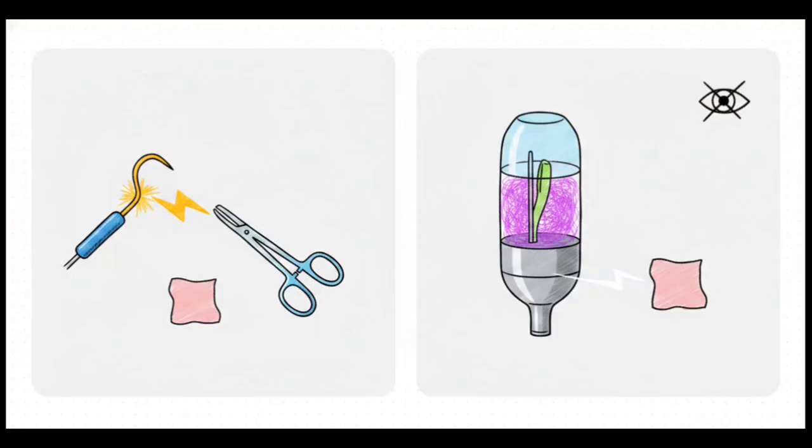Okay, you absolutely must understand the physics of electrosurgical complications for the exam, specifically the concept of coupling. Direct coupling happens when current purposefully or even inadvertently passes from a monopolar instrument straight through another conductive instrument. Capacitive coupling, on the other hand, is a bit trickier. This is where current actually stores up in an active electrode and then discharges through an uninsulated conductor. Think of a hybrid plastic and metal trocar.